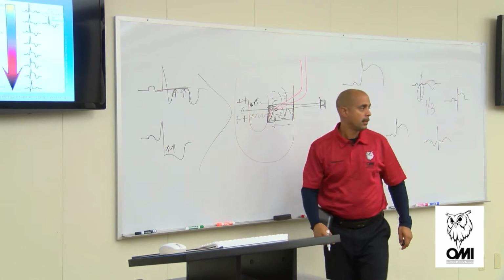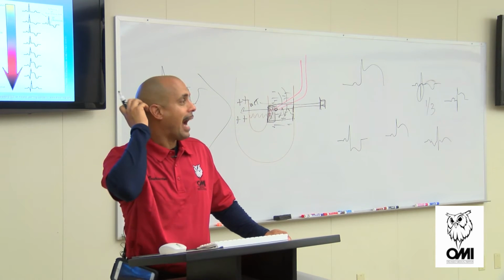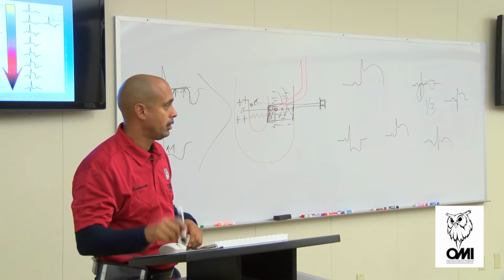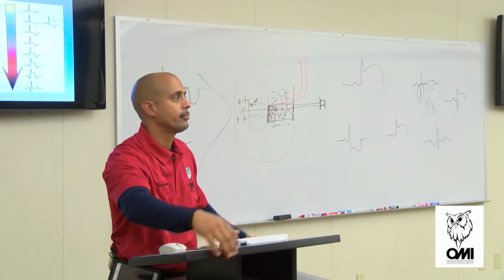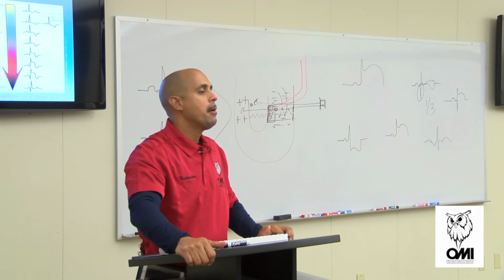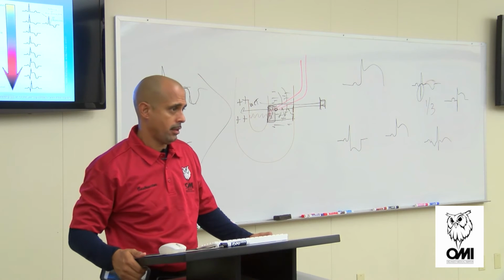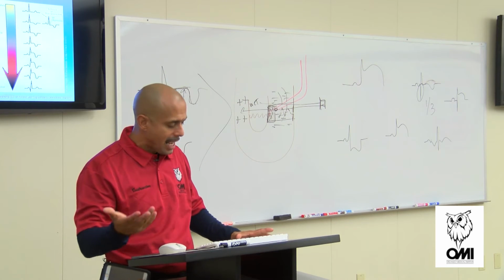What does this mean? Dead tissue. And what's around that dead tissue? Dying tissue, right? Injured tissue. We call that critical? Yeah, that's worse, right? So what are you going to do? Say it again? Get them to the hospital as fast as you can. Transport. Thank you. We're going to start the reperfusion and get them to the hospital as quickly as we can. But what are we going to do first? Reperfuse. I want to get you to the hospital as quickly as I can, but the quickest I can get you there is an hour. But all in all, can you start the reperfusion? Yes, so you need to.